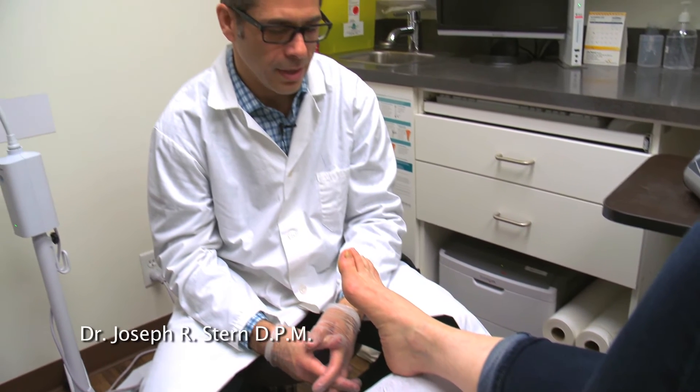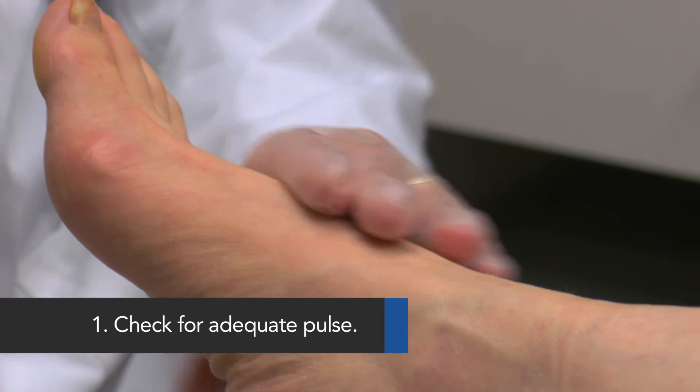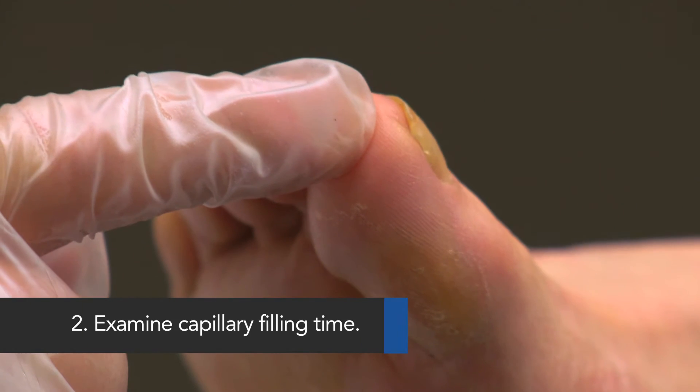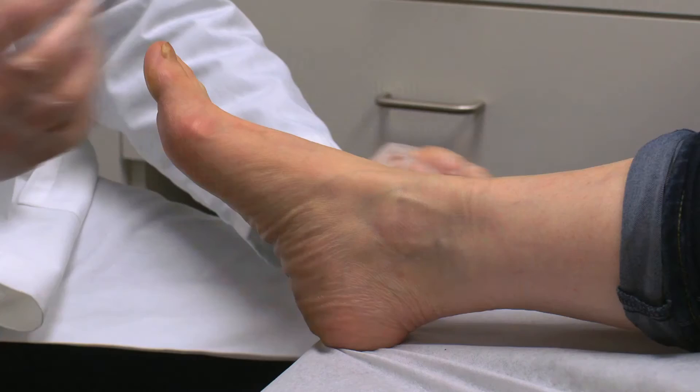It is important to conduct a simple pre-treatment examination on all patients. First, check for adequate pulse on top of the foot and behind the inside ankle bone. Second, examine capillary filling time on all toes by pressing lightly on the toe and observing blood rapidly returning to the capillaries.